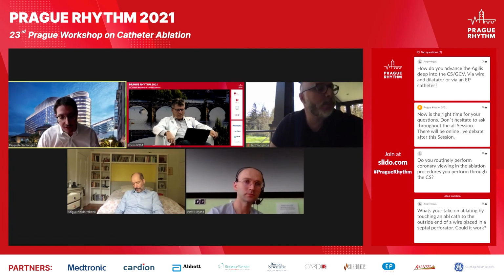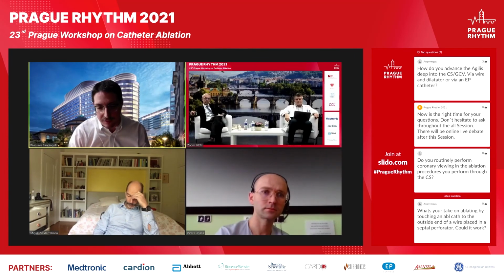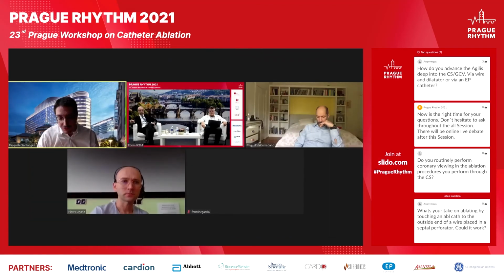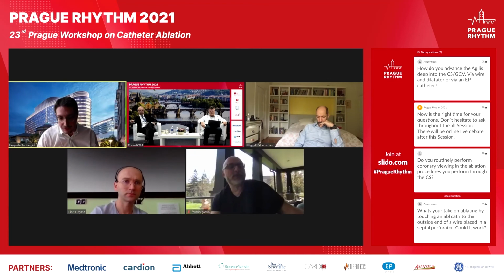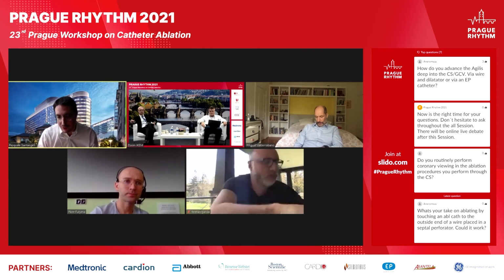I've been working mostly, honestly, on activation now, looking at just subnormal electrograms. We've pretty much abandoned voltage. For unipolar, we have some data we haven't published yet: the unipolar voltage doesn't change much, because you're referring to the Wilson central terminal, so it doesn't change much with multipolar versus single tip catheter. But for bipolar, there is a huge change in voltage. That's why we've been working mostly with activation and looking at slow conduction with abnormal split and late potentials, LAVAs, etc. That's the way we use these catheters mostly, and we don't really work in voltage.